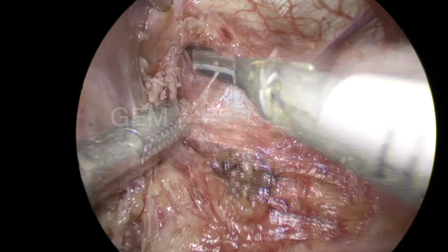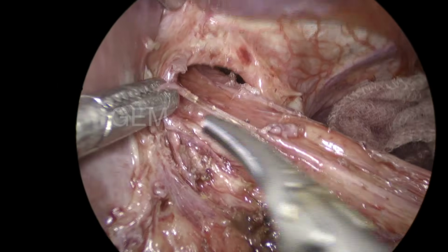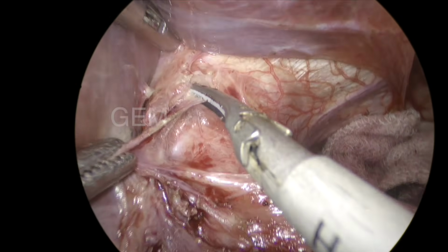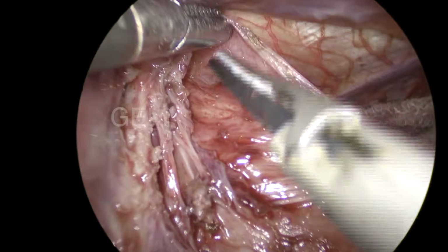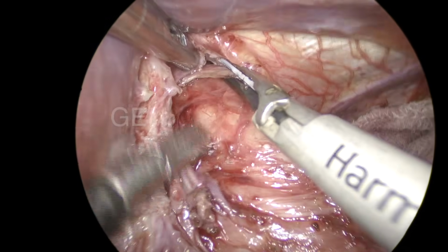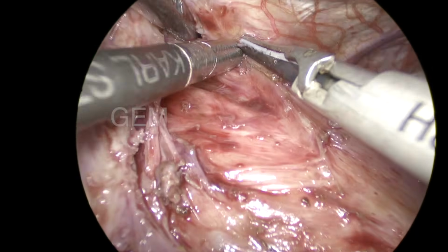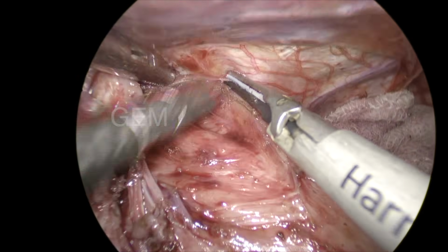This harmonic HD that I am using has a non-sticky lower blade, and it's a little bit sharp with a curved tip. I feel it is very useful in this type of fine dissection. You can see, I am holding even very small tissue, and then dividing it, and dissecting like this. Compared with the regular harmonic, I feel it is very much useful. And the sealing capacity is also more compared with the regular harmonic. So that is the vagus, the anterior vagus. It looks a little bit thicker, so I can divide that fascia.